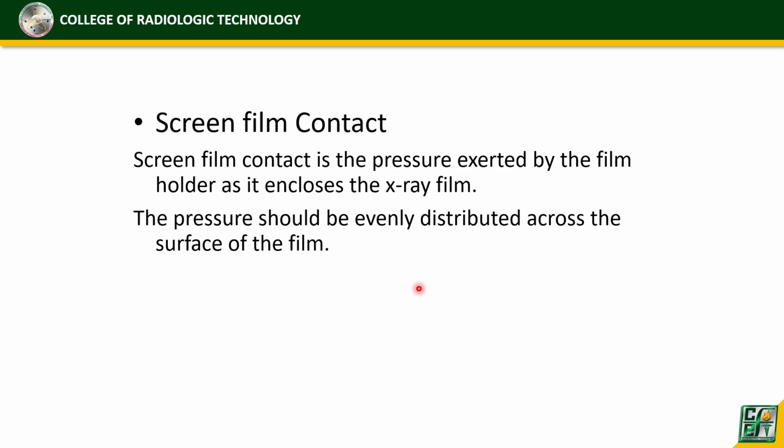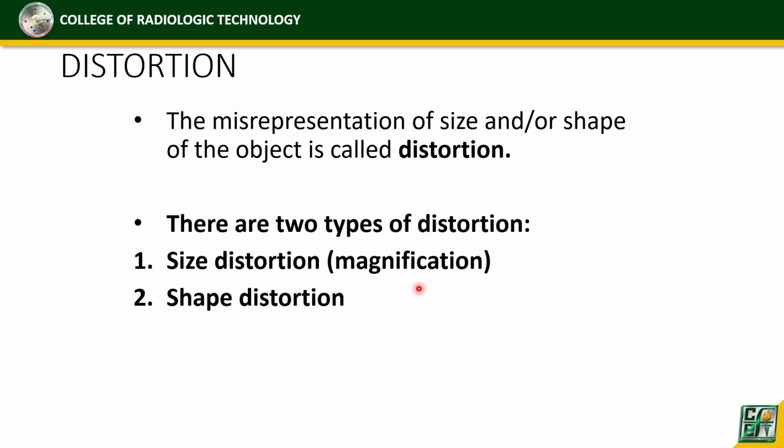So ano yung test na ginagawa dito? So sa QA/QC, the test used here is what we call the wire mesh test. Okay, so wala na ang explanation. So wire mesh test yun in order for us to make sure na lapat yung film sa loob ng cassette. Magkalapat yung film evenly at saka yung IS sa loob ng cassette. Kasi kung hindi, magkakaroon ng warping, magkakaroon ng distortion.